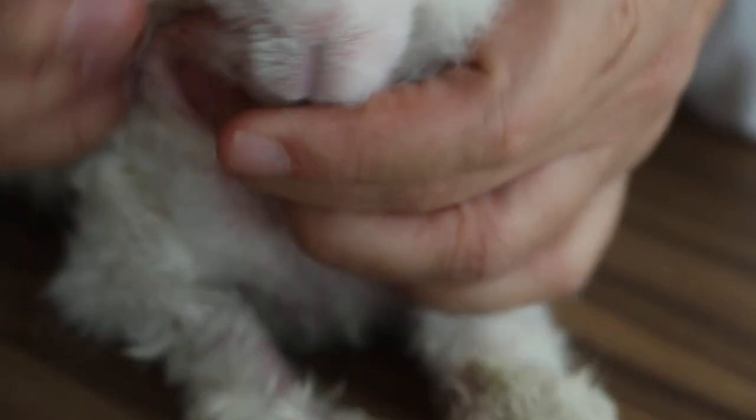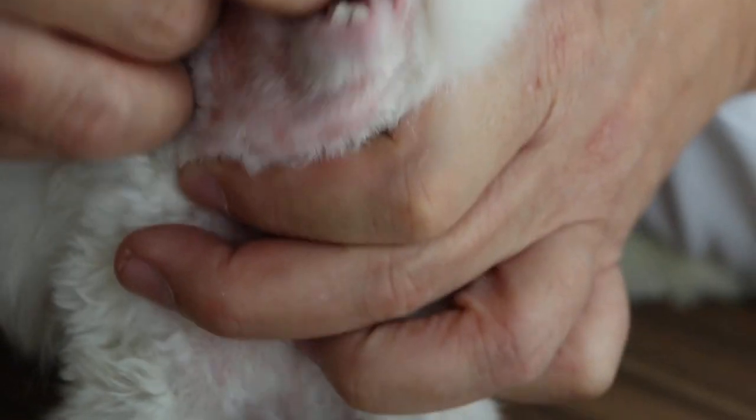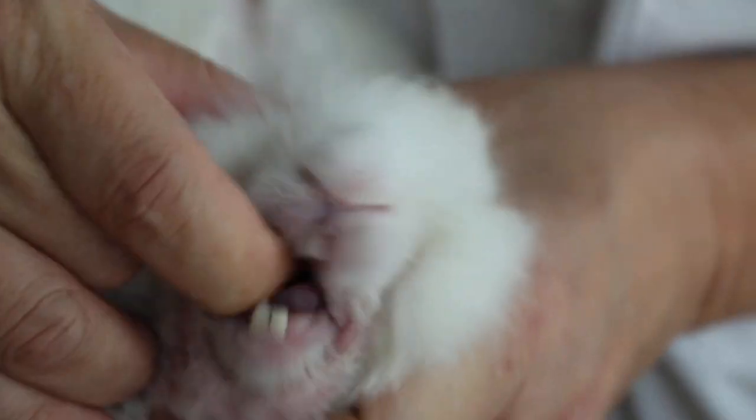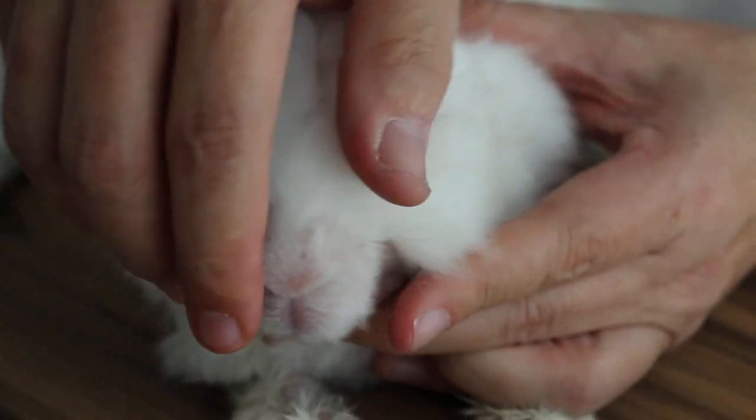So what we do is, we need to sedate him to trim the molars. The molars — you can feel it, the molar spurs are quite sharp. Without sedation, it's very hard to trim.